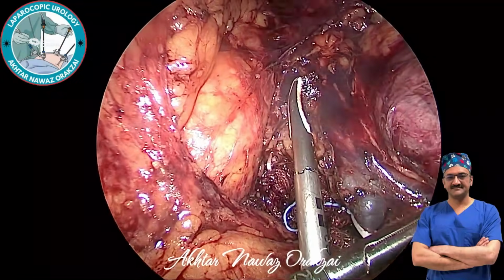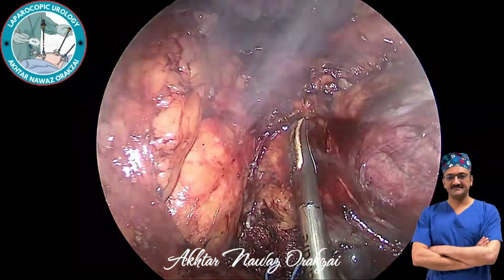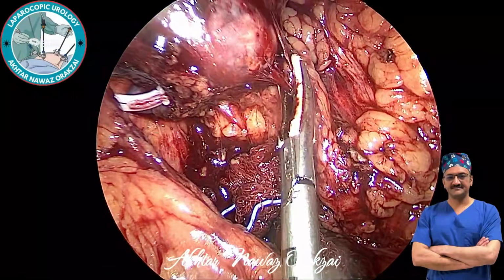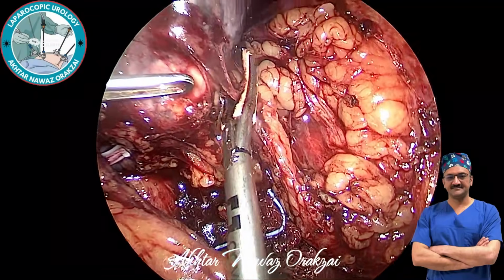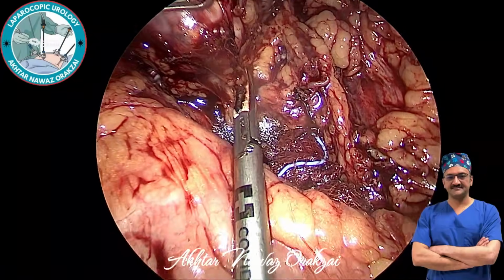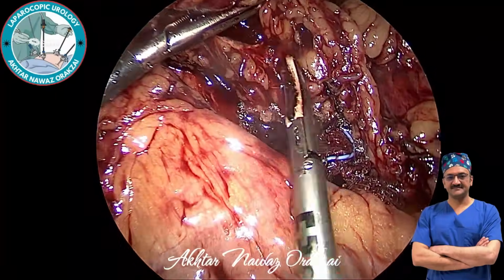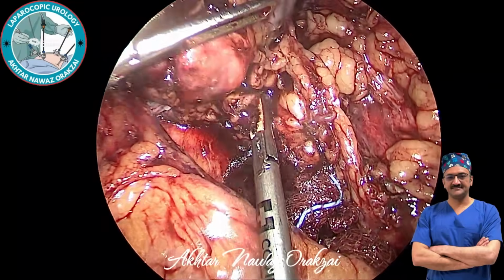Personally, I feel that the left-sided adrenal gland is easy to remove as compared to the right-sided adrenal gland, and the reason for that is that you can usually see all the three arteries which are supplying. And secondly, the vein is usually draining into the renal vein.